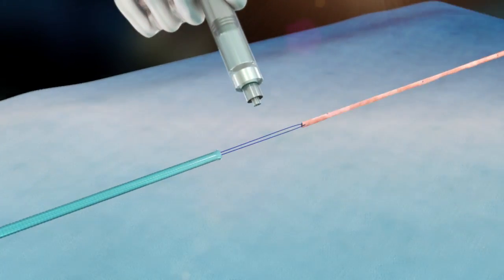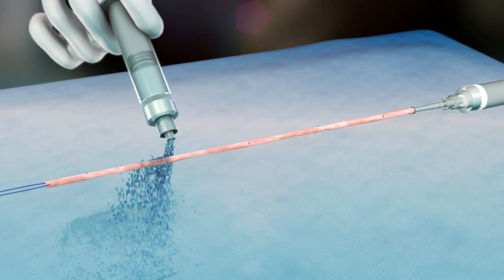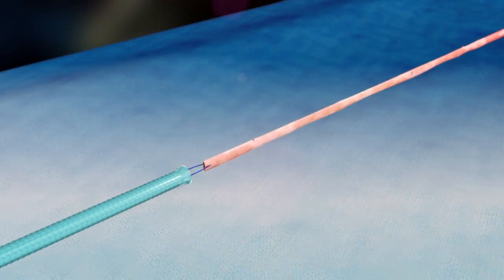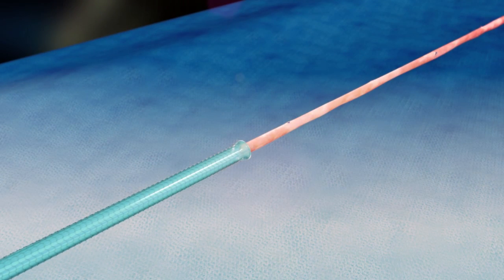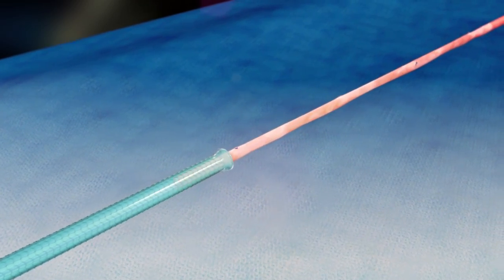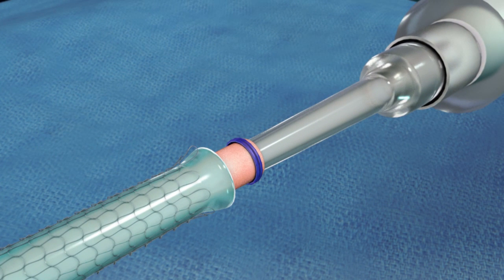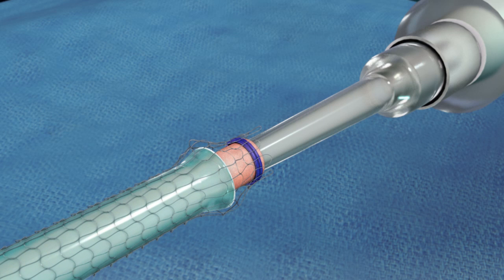Next, gently wet the inside of the delivery tube and the outside of the vein with heparinized saline. Straighten the vein so that it lies without twist and align the delivery tube with the vein. Holding the suture tails in one hand, gently grasp the everted end of the delivery tube with the other hand and carefully push the tube over the vein to the cannula tip. Avoid twisting or stretching the vein. If any resistance is encountered, stop and check to make sure no fluid or air is trapped in the vein. Push the distal end of the mesh over the vein and cannula tip and affix the mesh to the tip with a suture tie.